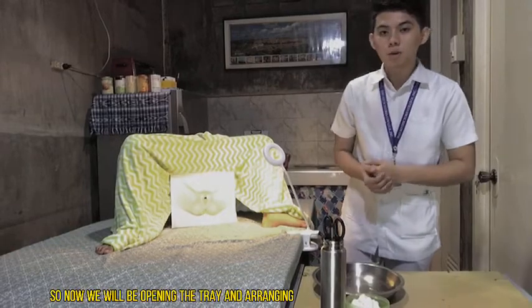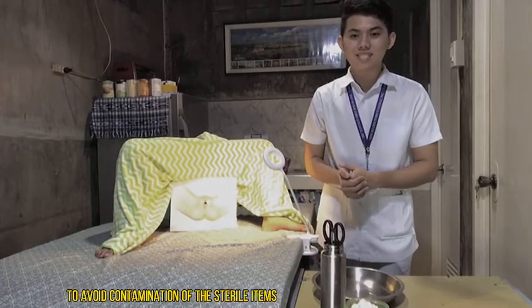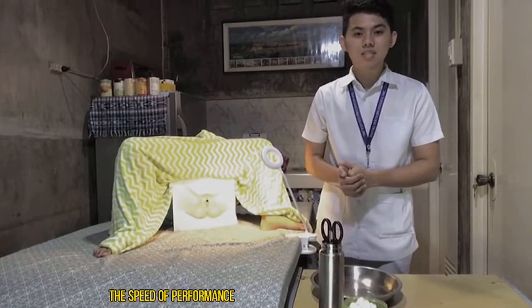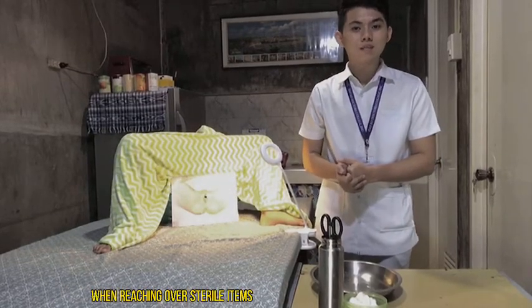So now we will be opening the tray and arranging the equipment for convenience and accordingly to avoid contamination of the sterile items. This is important because placing the equipment in order will increase the speed of performance and will also help us decrease the risk of any contamination when reaching over sterile items.